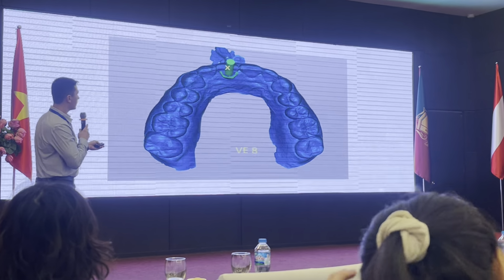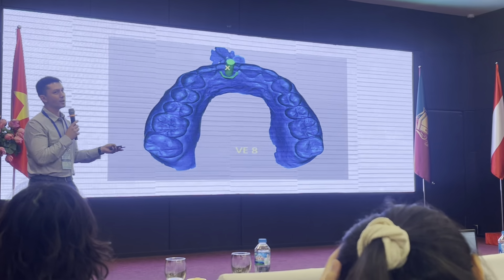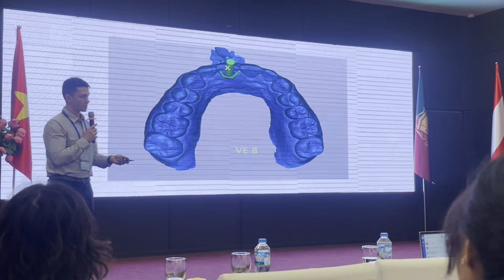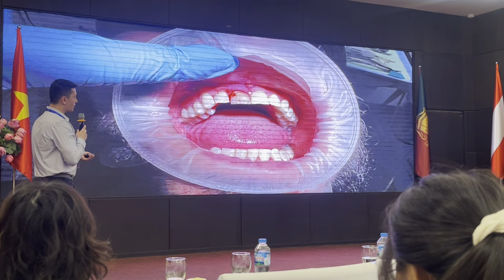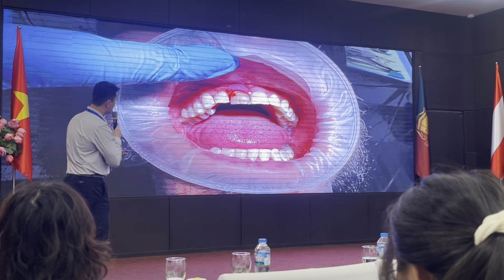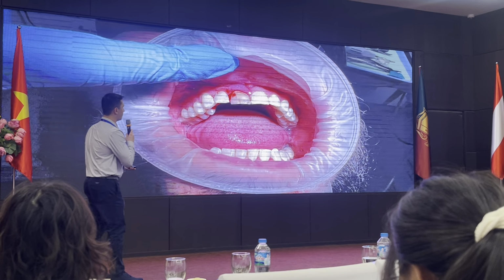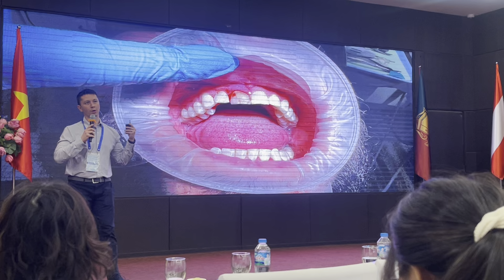And we have it right out of the lingual surface of that front tooth, the cingulum. This is an ideal position for a screw retained restoration. And so the day of surgery comes, we're using this. You might notice that we're showing this kind of clear plastic film that helps just retract the cheeks out of the way.